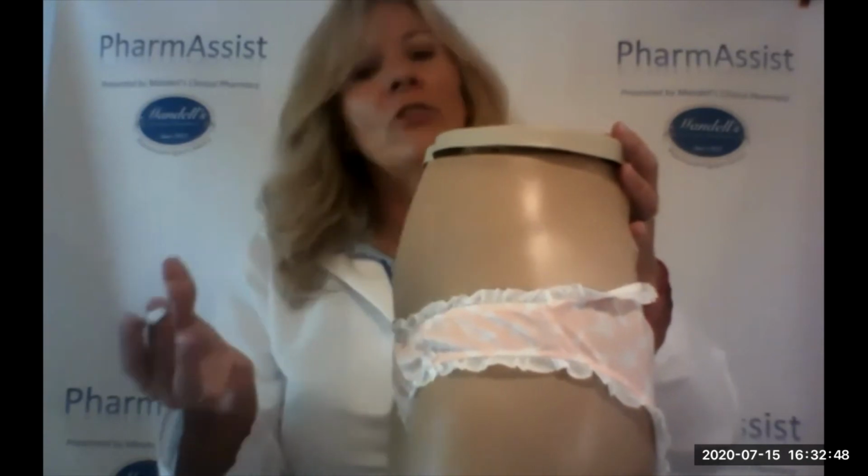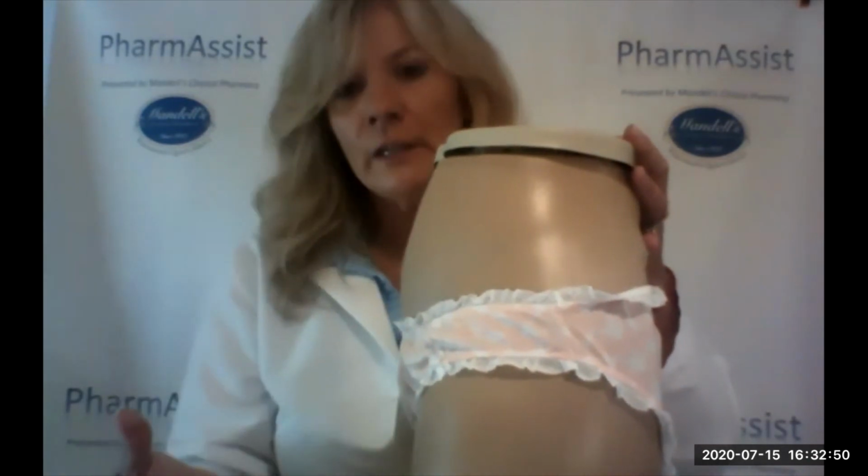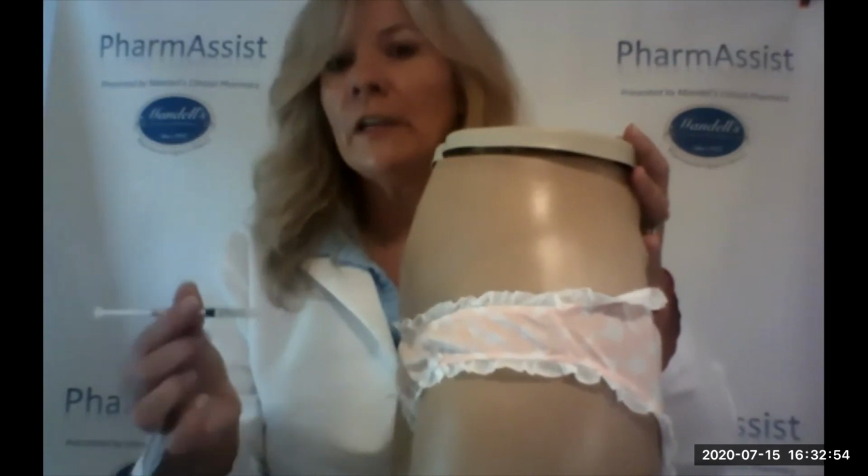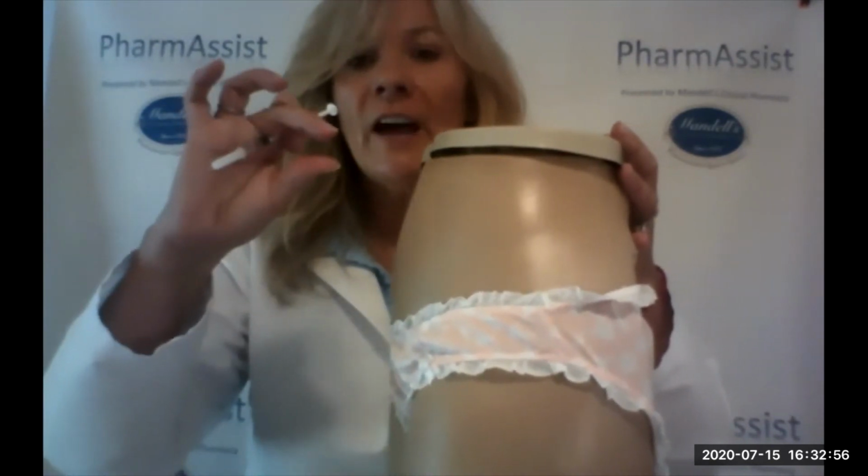And a big question I always get asked with the shots is, does all the needle go in? And you actually really do need to make sure with this one that all the needle goes in, because you're really only putting in a 1/2-inch needle.